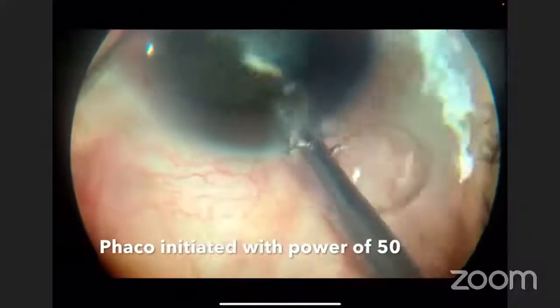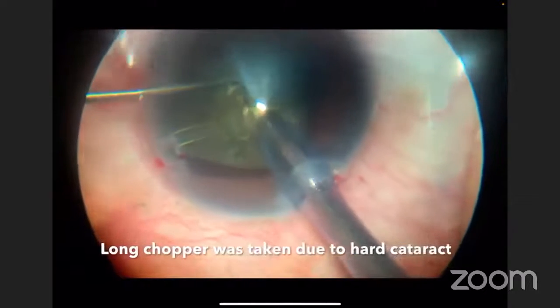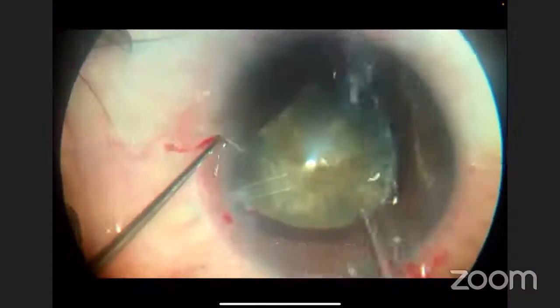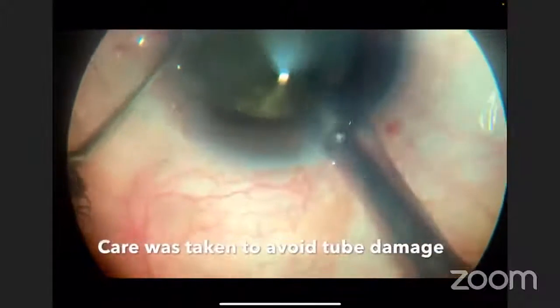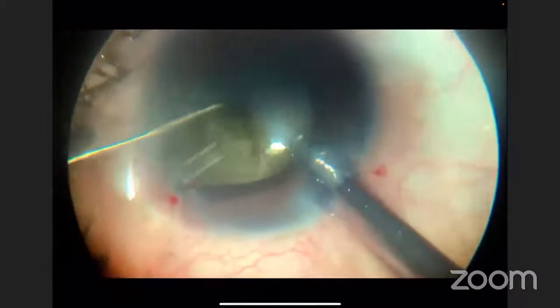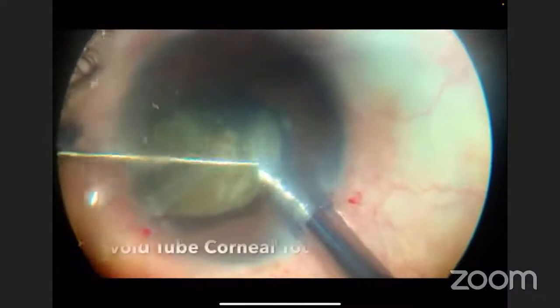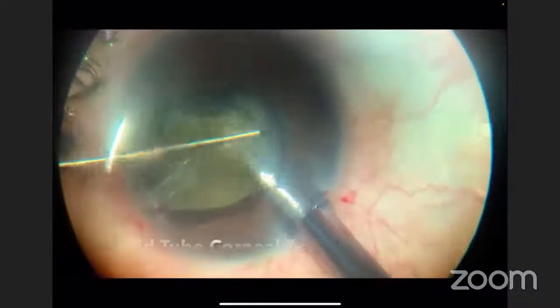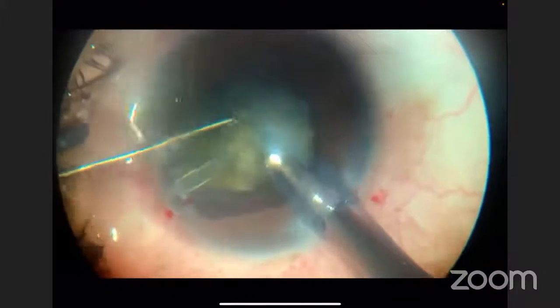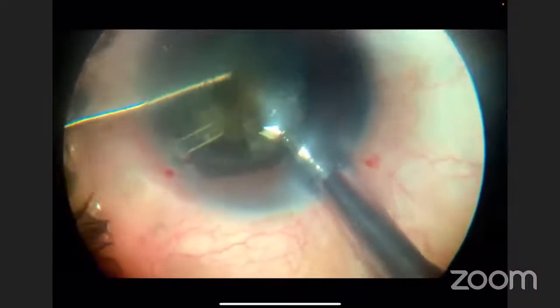Now, while doing phacoemulsification, it is important to check that you don't touch the tube or you don't push the tube. This is a long chopper I used because it was a hard cataract and direct chop I was doing. Now, it is important to make sure that minimal amount of phaco energy is being used and you do in-the-bag phacoemulsification to avoid any endothelial cell decompensation. Now, the studies have also shown that the direction of the tube and the angulation of tube is also important. And in fact, this has been negatively correlated with the endothelial cell loss.